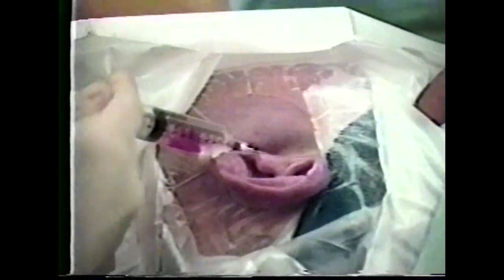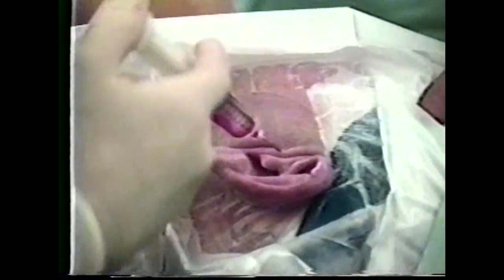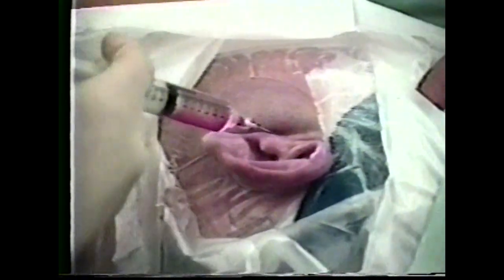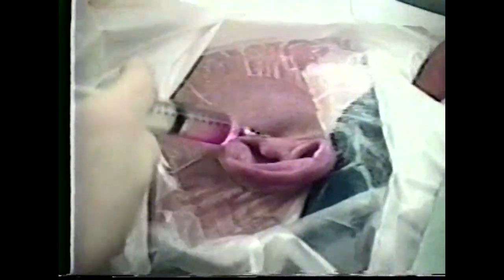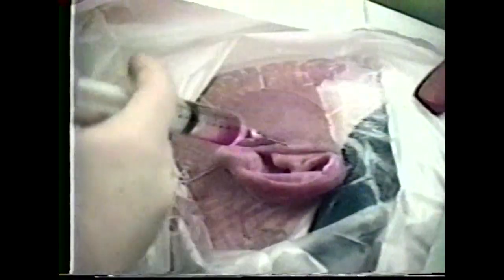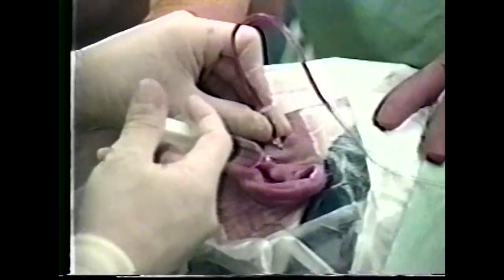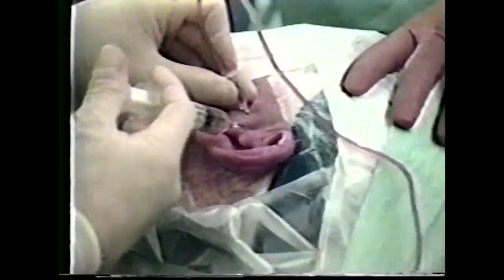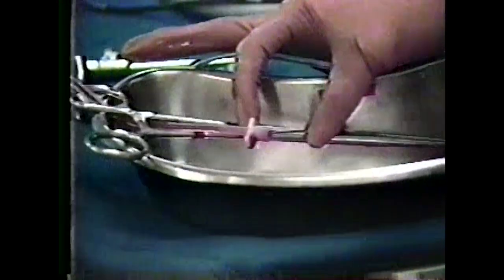Remember to angle the needle at 45 degrees anteriorly, superiorly, and medially. This will aim it at the posterior slope of the articular eminence and away from critical structures. The outflow needle and tubing are now placed anterior laterally. Immediate outflow through the tubing is confirmation that the inflow and outflow portals are in the same joint compartment.